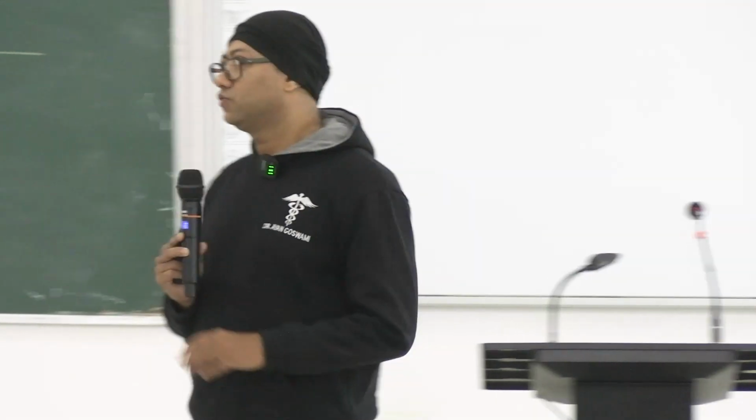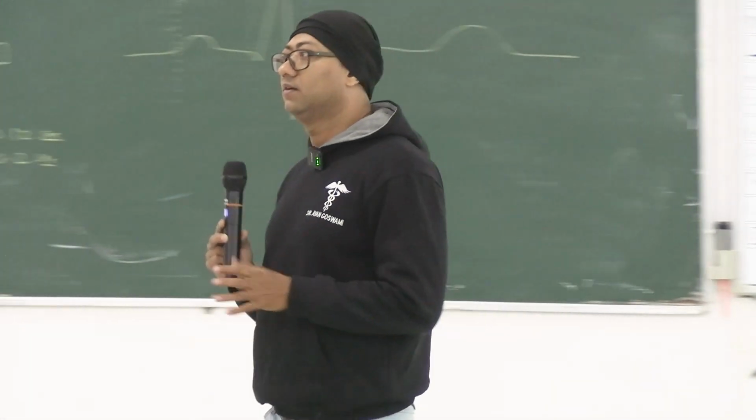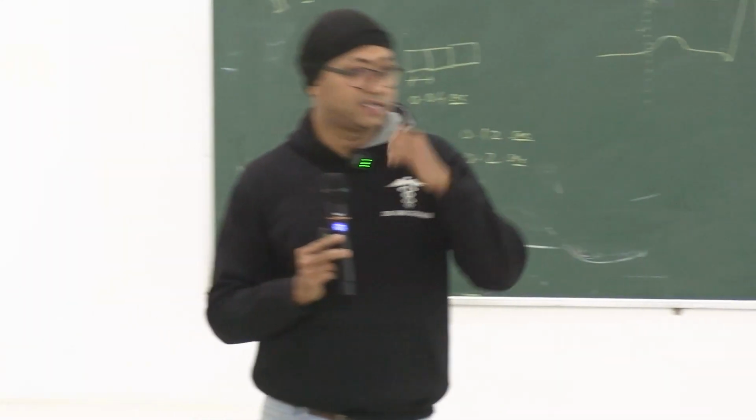Anyway, treatment is not required for your level. What is required, you need to identify by seeing an ECG what is first degree heart block, what is second degree heart block, Mobitz type 1 and type 2, and third degree heart block. Clear everyone? Okay. So today's was a small topic. I will not talk more because also attendance is less.